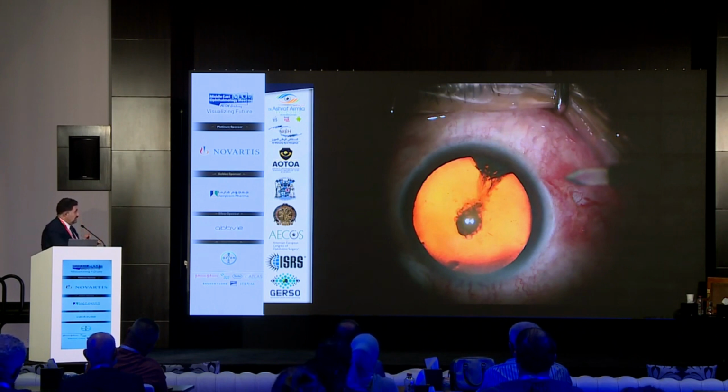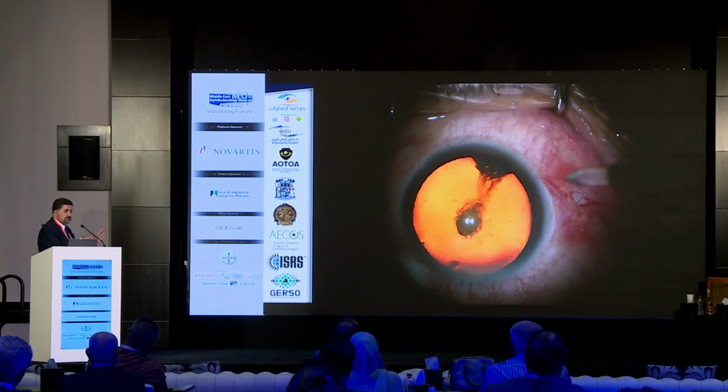You cannot find a cataract like this. There is a cataract here, and there is a track. So definitely, this is an abnormal cataract and related to the trauma. So you should expect that this is an abnormal site for the cataract. So this is what was in my mind before I start surgery, and I planned everything in the operating room.